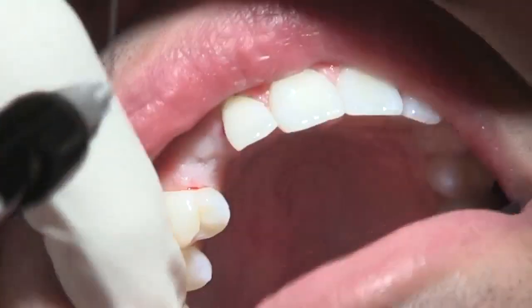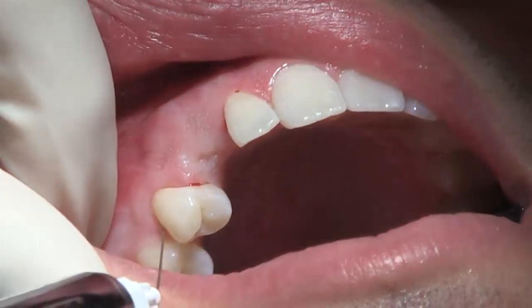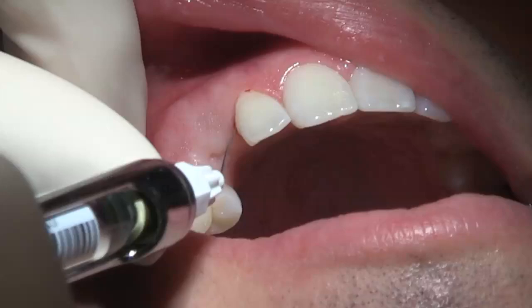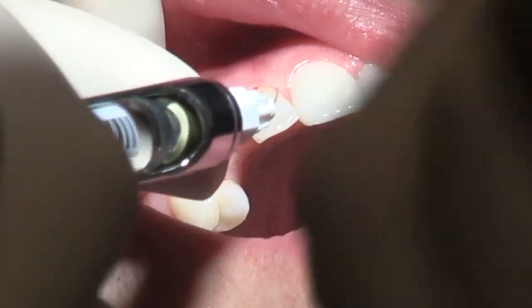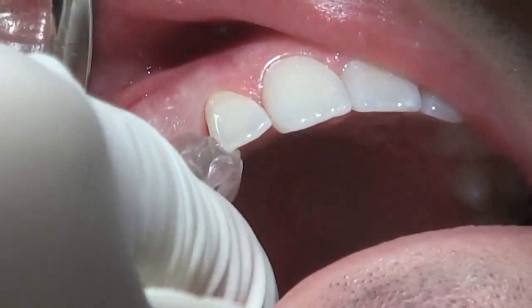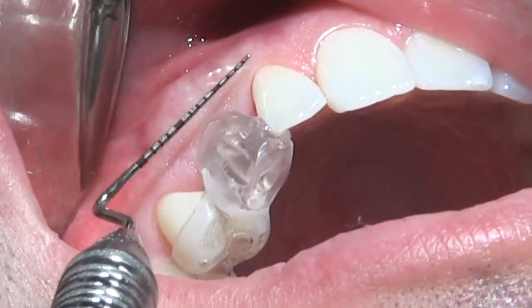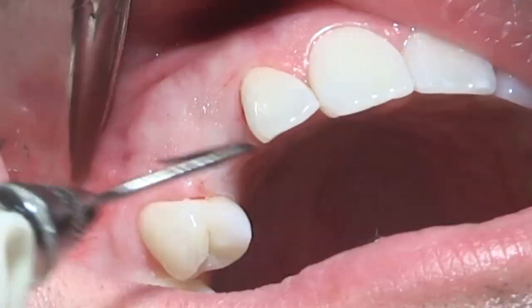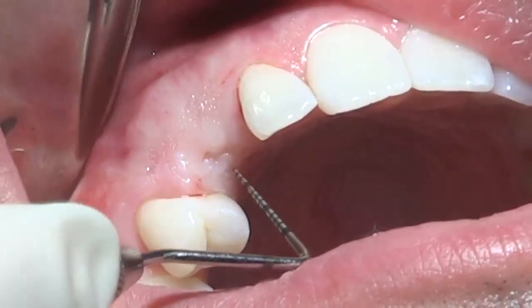We start off with local infiltration anesthesia in the buccal vestibulum, in the palatal vestibulum, and in the marginal gingivas, including the papillas. Periodontal probes are being used to sound to the bone. The surgical guide stent is applied and evaluated with the surrounding soft tissues just prior to starting the procedure.